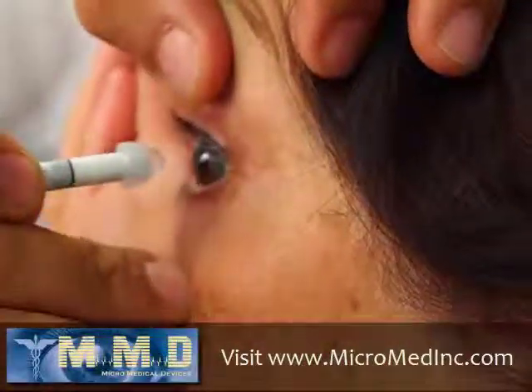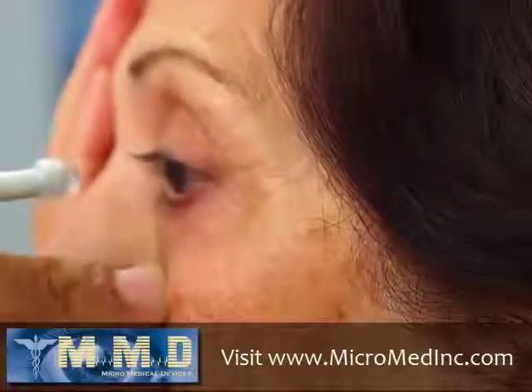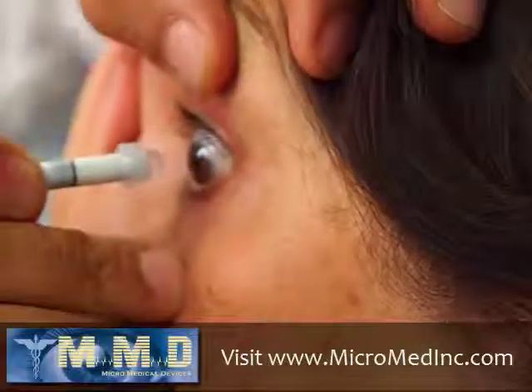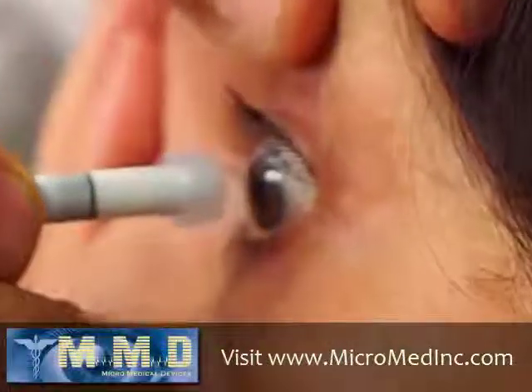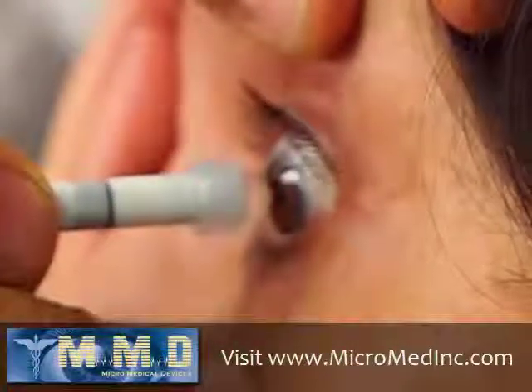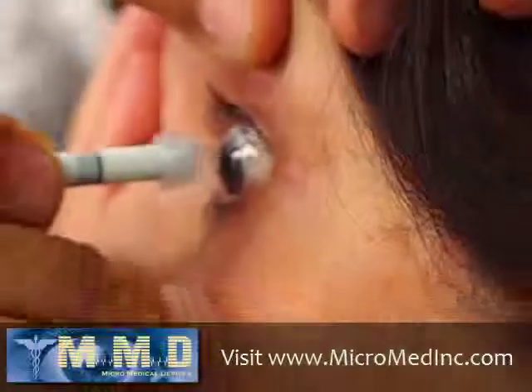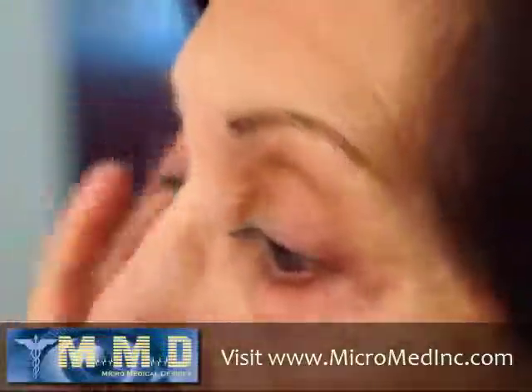Look at the blinking light. And just gently come forward until the meniscus is touching the eye, and instruct the patient to look at the blinking light and you're done.